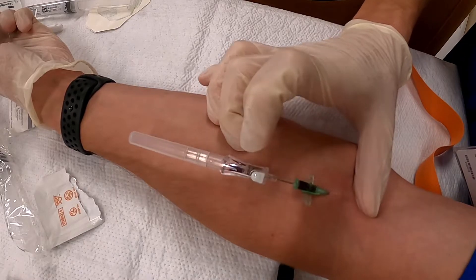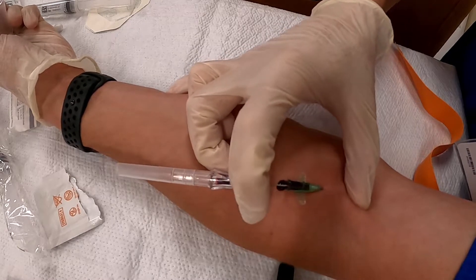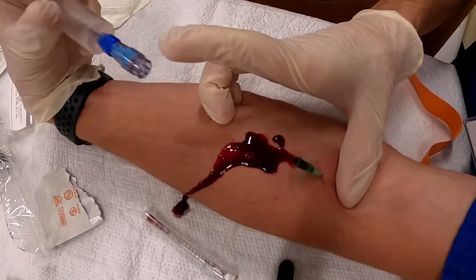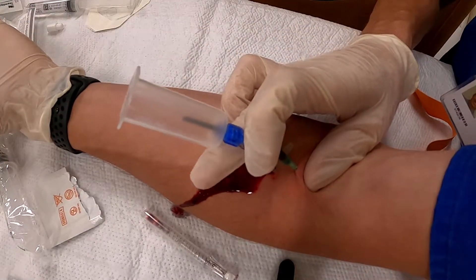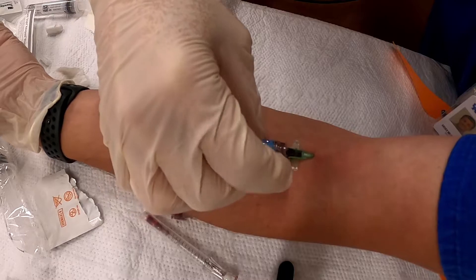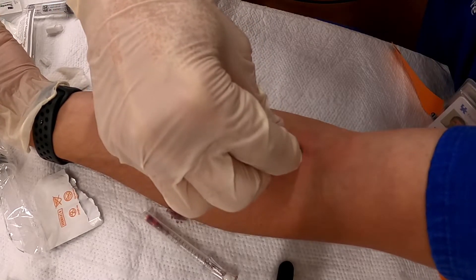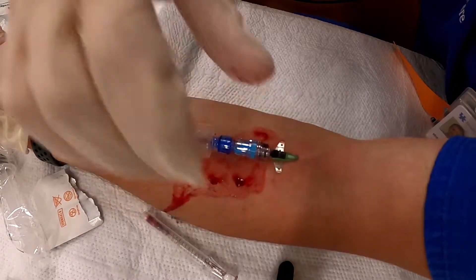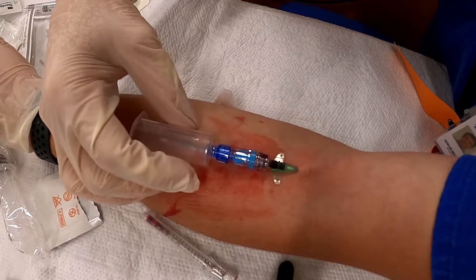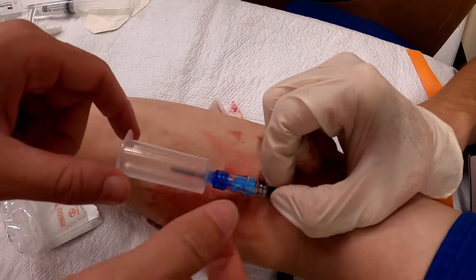This is tough — I'm trying not to make a bloody mess. You don't want that on your video. It's not going to be any way not to make a bloody mess. Okay, we got the hard part done. I didn't want to wear gloves because these aren't very tight fitting, but it's hard to do one-handed. If you could just tighten that up for me, that'd be beautiful — the hard part's over with.